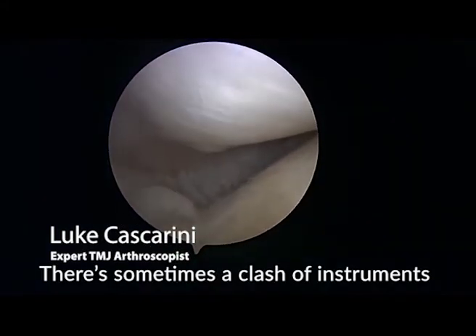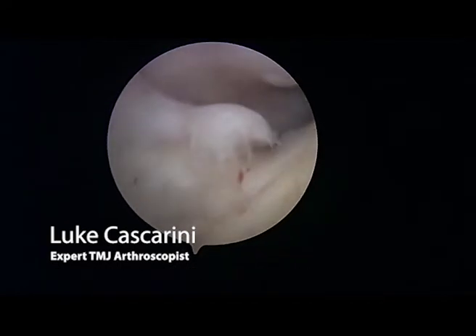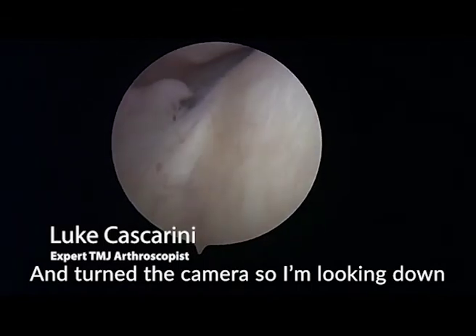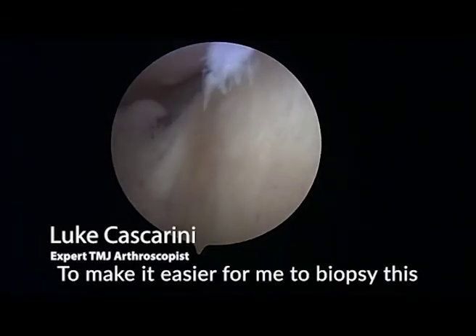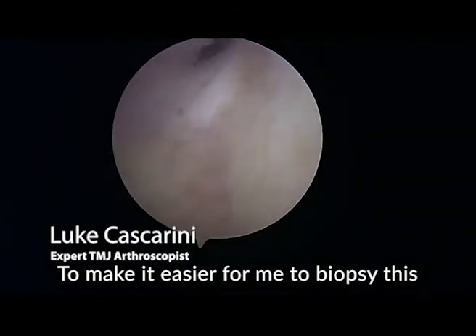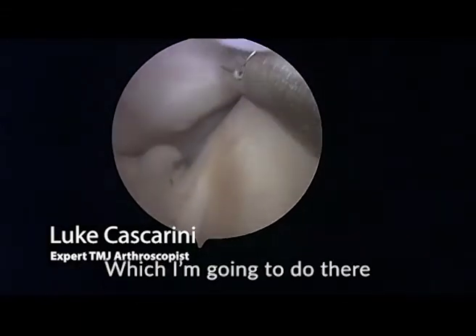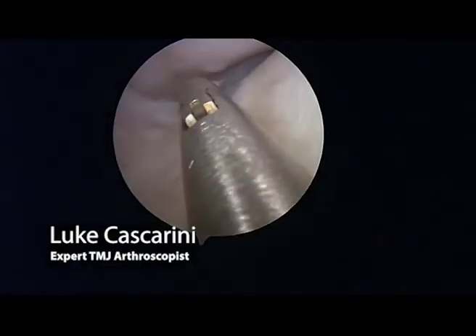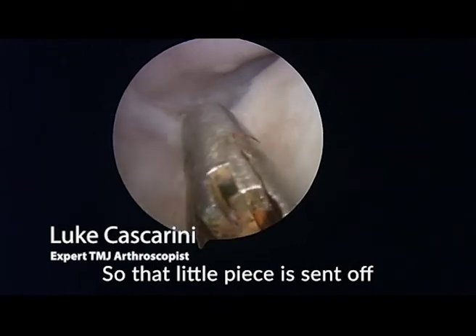There's sometimes a clash of instruments because it's such a small joint. What I've done here is moved the scope above and turned the camera so I'm looking down, to make it easier to perform the biopsy without the instruments clashing. That little piece of tissue is now sent off for analysis.